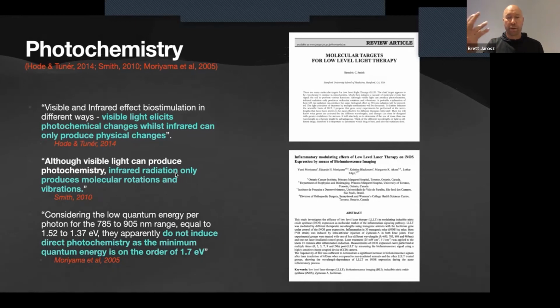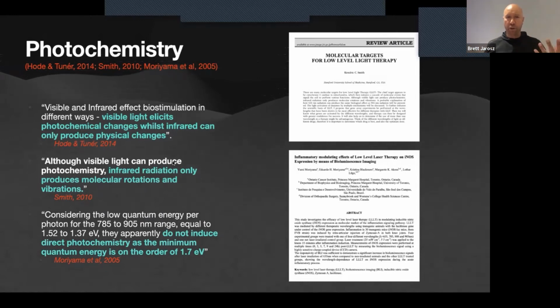And as we'll go to in the next slide, in particular, water. Water absorbs infrared. So it said for therapeutic effect, we've got to absorb the light, absorb the photons, and water is what absorbs infrared. And then we'll start to think about how the human body's structured. And most of us are, depending on what research you read, let's just say 70+% water.